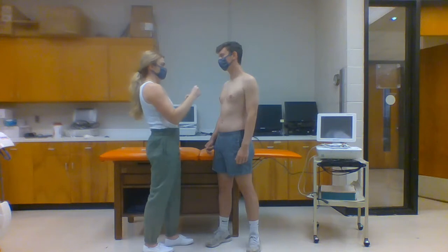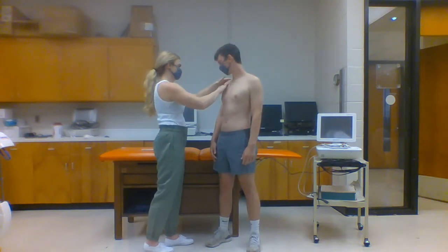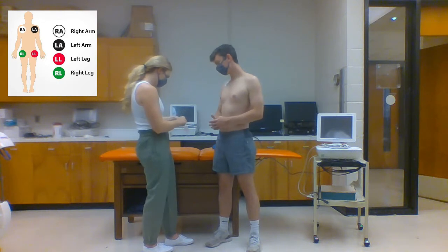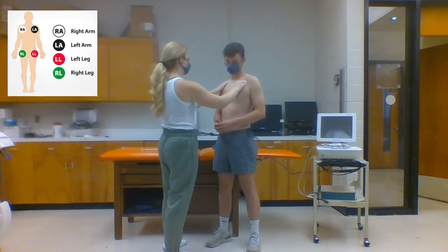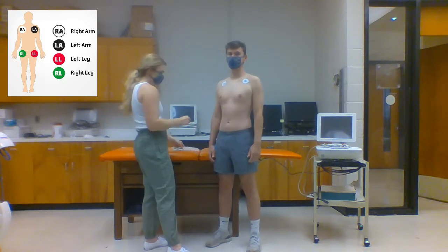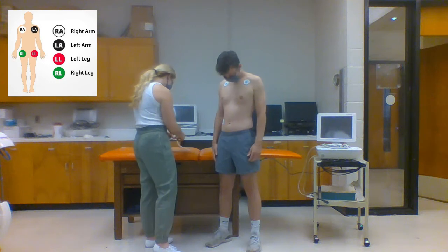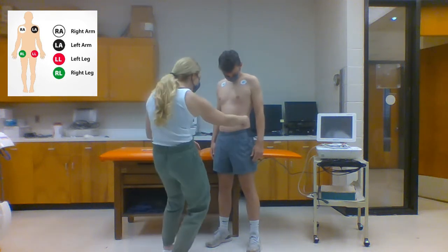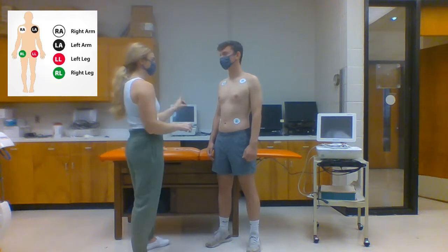The right arm is placed just below the midpoint of the right clavicle. The left arm is placed just below the midpoint of the left clavicle. The right leg is placed in line with the right arm electrode on the torso just below the final rib. And the left leg electrode is placed in line with the left arm electrode on the torso just below the final rib.